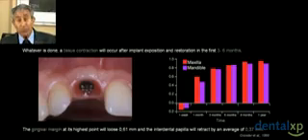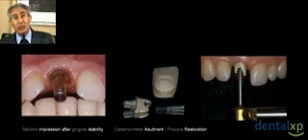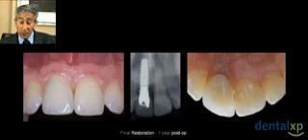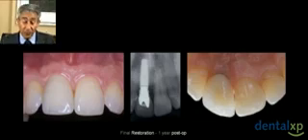We have removed the cover screw, take the opportunity to have an impression taken, and plug here in this envelope flap a connective tissue graft. And that gives us a fantastic opportunity to increase not only the thickness of the ridge but also the quality of the biotype. So this biotype definitely is more resistant, even though it's going to retract, as Grunder is saying, by 0.61, but we have done such in excess augmentation of the tissue that even though it will retract, we still have enough. Then we took the final impression, we put the abutment, and this is the final result.